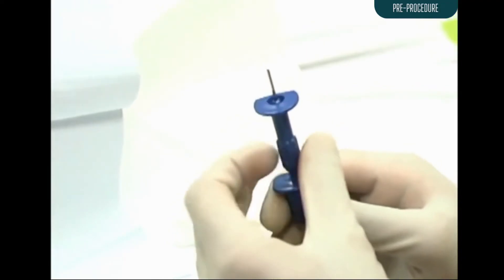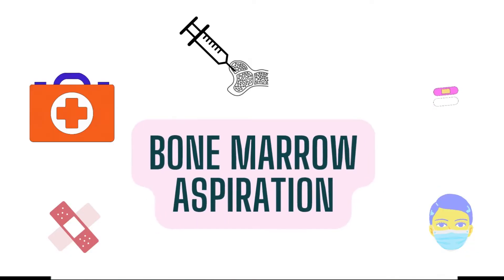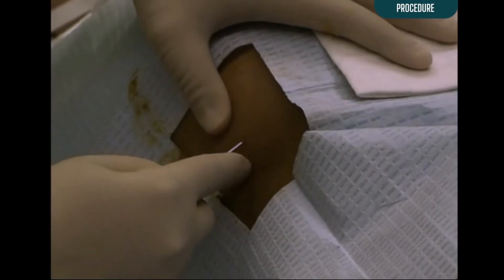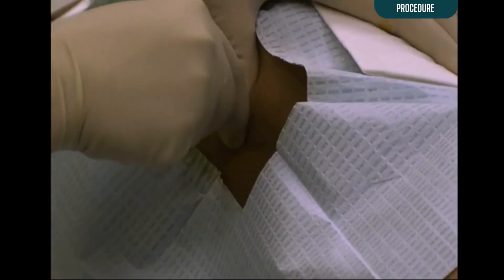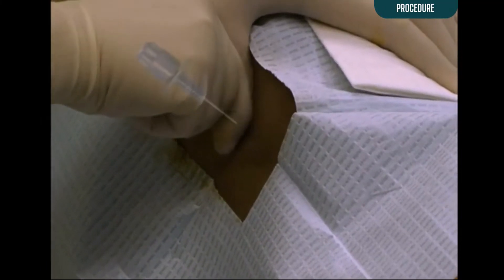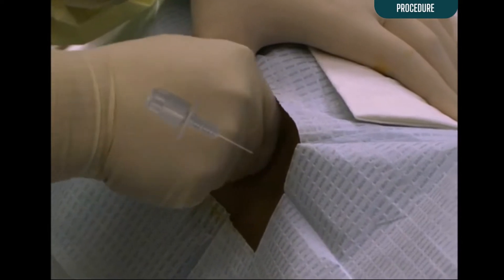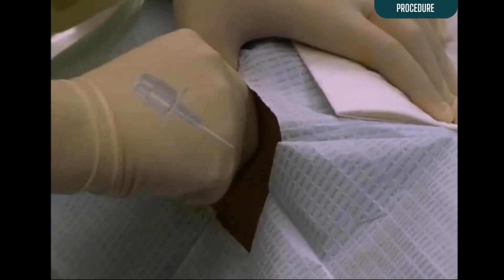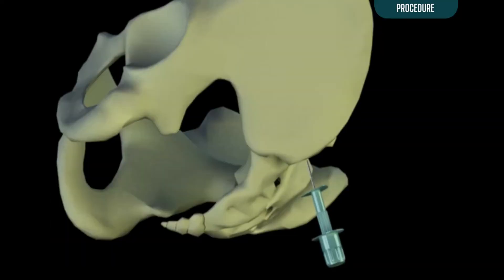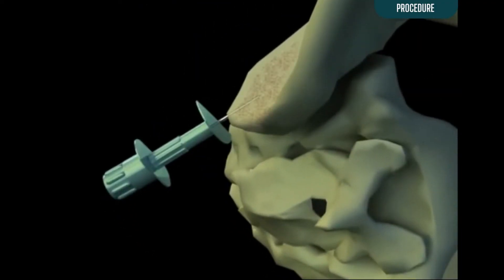Inspect the bone marrow aspiration needle and remove the plastic guard if one is present. Hold the needle horizontally and insert it into the skin over the posterior iliac crest. Advance the needle until it contacts bone. To engage the bone, the needle should be rotated alternately clockwise and counterclockwise while applying steady pressure. When the marrow cavity is entered, a sudden decrease in resistance is usually felt. The ilium is a large bone and the marrow space should be located easily.